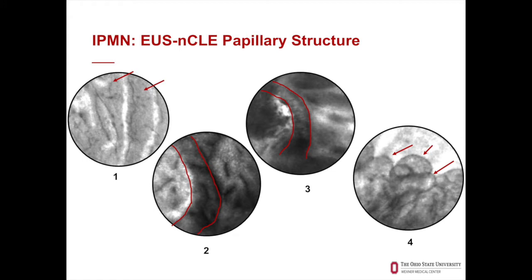These papillae are seen in various shapes and forms. Here are various possibilities. You have overlapping papillae as shown in figure 1. Figure 2 shows the transection of a very large papillary structure with outer epithelium, inner vascular core. Figure 3 shows a much darker papillary epithelium with some nuclei near the basement membrane. Again, it's a kind of a transection. And figure 4 shows IPMN with low-grade dysplasia. The papillae are thin, the epithelium is thin, and there are multiple papillae in the field of vision.